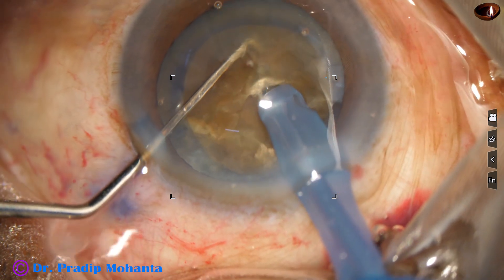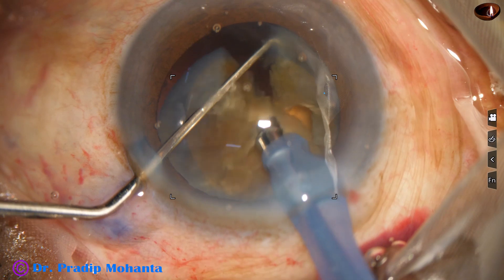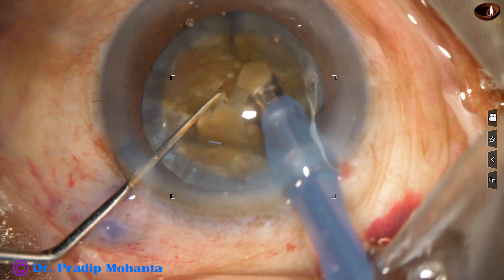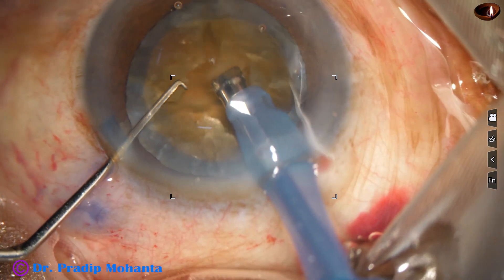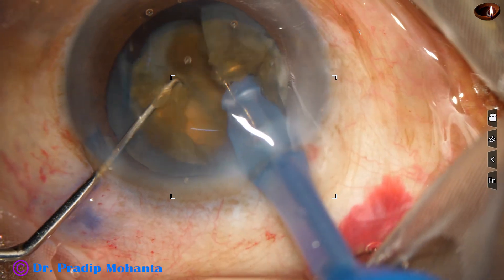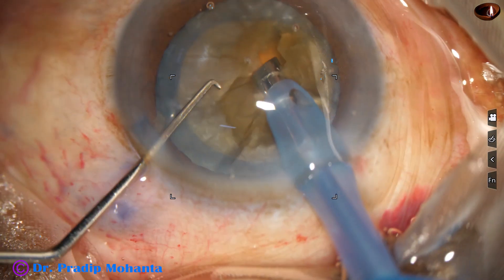In this case, the cataract is so hard that there is an endonucleus — a very hard endonucleus. This is emulsified and removed. Now we can work on the rest of the nucleus, which is being chopped into fragments.